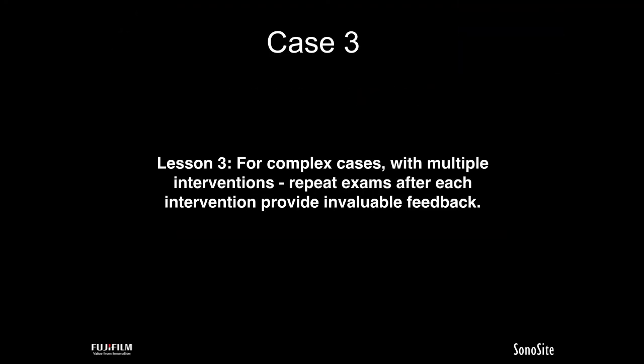So lesson 3 for this more complicated case is that when you're doing multiple interventions, so maybe we adjusted the PEEP and maybe we added some milrinone, we would do all of those things one at a time when we have a bit of time and repeat our hemodynamic assessment to be able to determine what worked best for these patients. Enough of protocolized medicine. You're an expert resuscitative doctor. You're at the bedside. You have this quantitative approach. Use it to identify what worked. Kitchen sink therapy is useful for patients who are dying rapidly, but when you have a bit of time, repeat the study, determine what works, determine what doesn't, and then use that feedback accordingly.